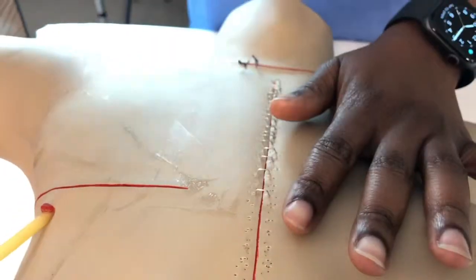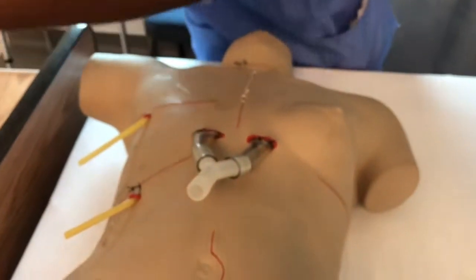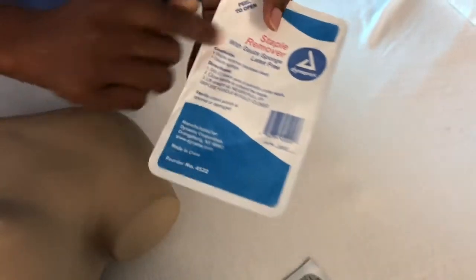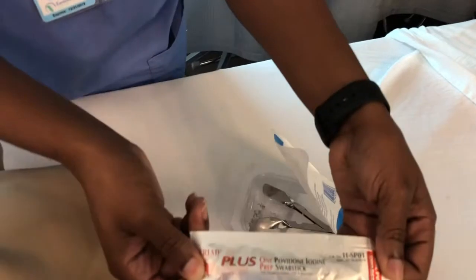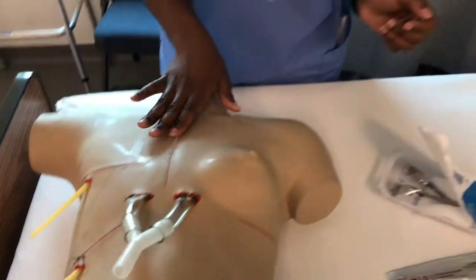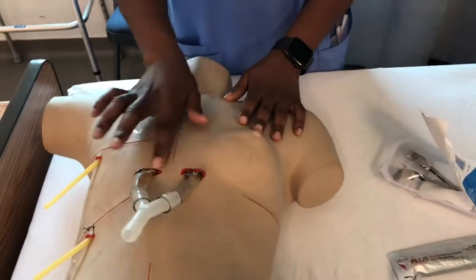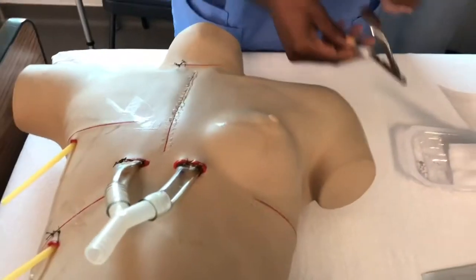Now before you do this — this is the staple remover kit. It comes with gauze to help wipe any blood. You want to use the betadine wipes to clean the incision area. Don't touch it directly, just clean around the area.